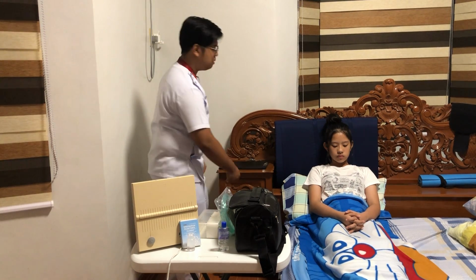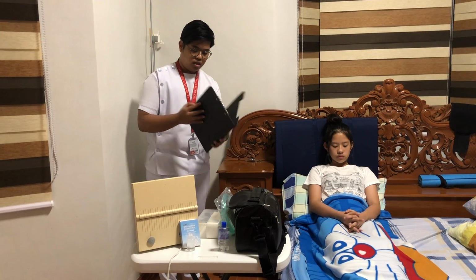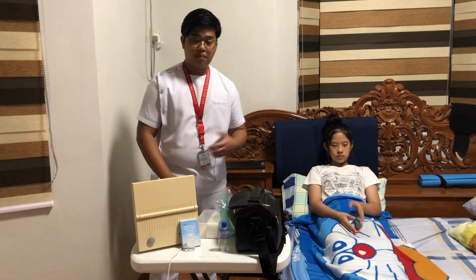And then after preparing the materials, we're now going to keep in mind to avoid any kind of distraction or interruption when preparing or administering medication in order to prevent medication errors. And then afterwards, we need to verify the doctor's order, which we have here on the bedside. So we're going to verify the doctor's order, which is salbutamol Duavent for the patient.